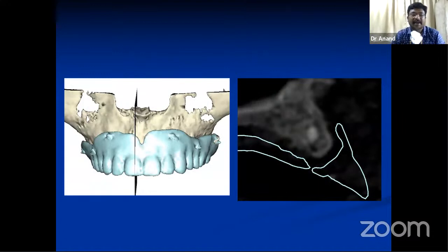And these are some of the third-party applications. Here I have used a third-party application where, see, it is a complete denture. Since most of the persons here are radiologists, if another person from a different field, like the surgeon, asks you what is the position at different regions, will you be able to assess it? You don't have standard landmarks to know which is 1-4, which is 1-2, which is 1-3. If you assess it in relation to 1-2 and then give it to the surgeon, he would put it in relation to 1-3 and say, I didn't have much bone there.